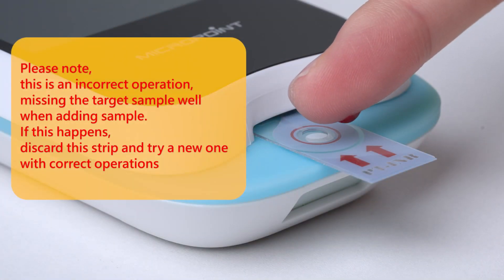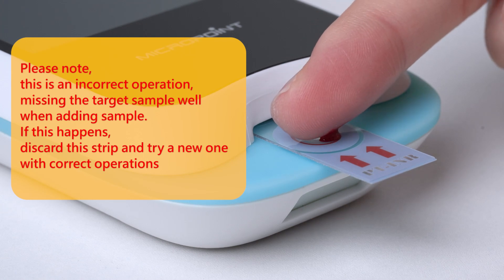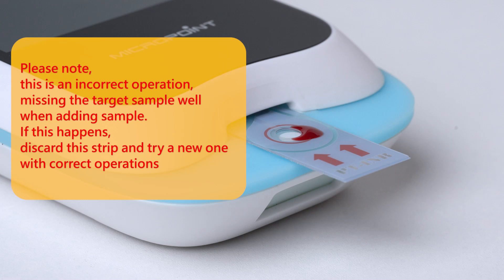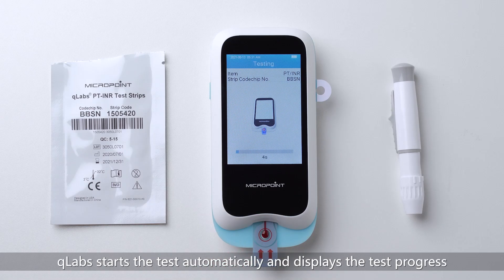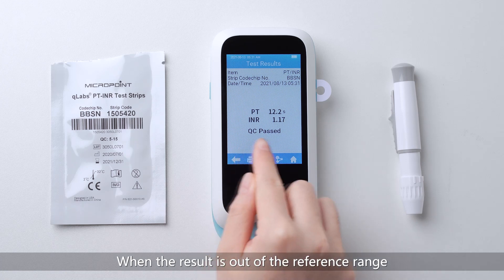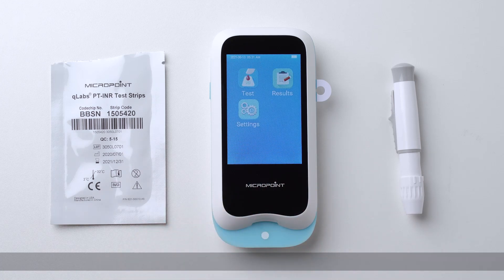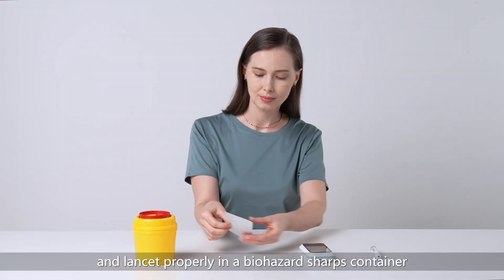Note that missing the target sample well when adding sample is an incorrect operation. If this happens, discard the strip and try a new one with correct operations. After the sample is added properly, the Q-Labs starts the test automatically and displays the test progress, then prompts test results after the test. When the result is out of the reference range, the Q-Labs will display the result high or low with an arrow. Dispose of the used test strip and lancet properly in a biohazard sharps container.